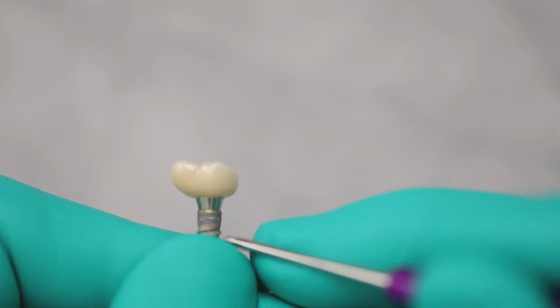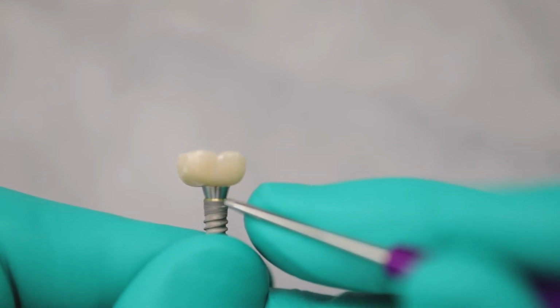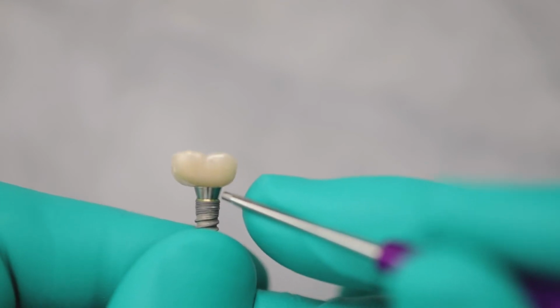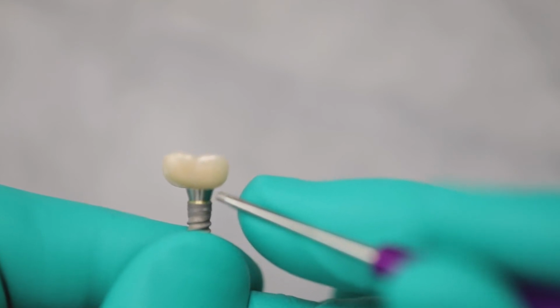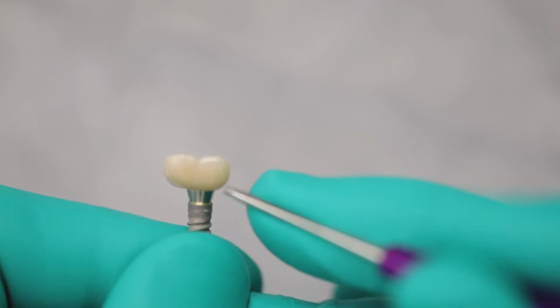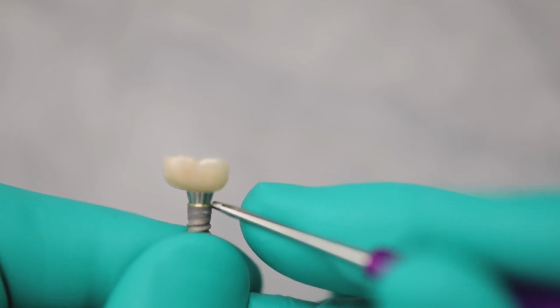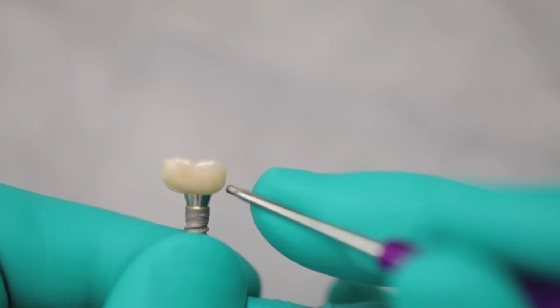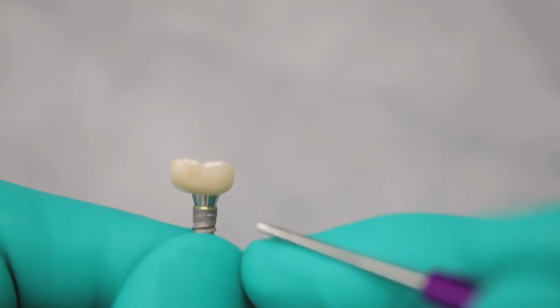If this had not failed, if this implant hadn't avulsed out of the mouth with the prosthesis, if we simply knew with this implant in place that we didn't want a Snoopy, we would have chosen a different abutment, you see. We would have chosen an abutment that was lower or a custom abutment that allowed us to come out and fill this area in on either side, right here, fill that area in right there with restorative material, or if you were doing cement retained, just fill it in with a custom abutment, keeping the margin of your custom abutment within 1 millimeter of the sulcus so you don't have any issues cleaning it when you do your cementation. And you would probably have a solution that would last a very, very long time.